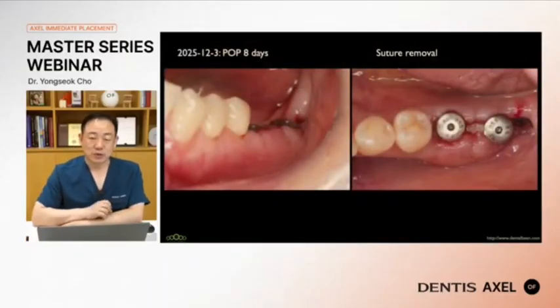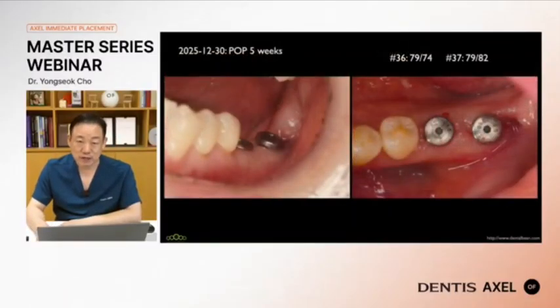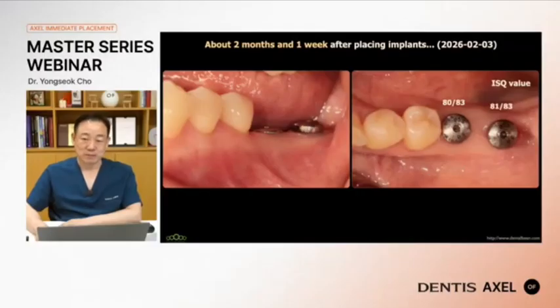8 days later, suture was removed, and 5 weeks later, ISQ value increased nicely, and started crown restoration 2 months and 1 week after the operation.